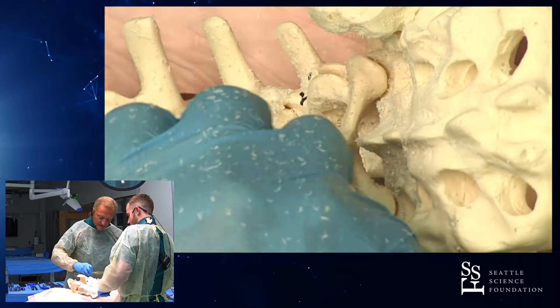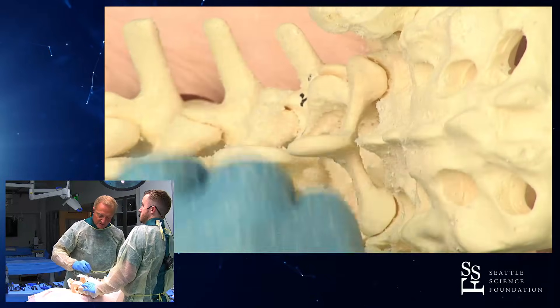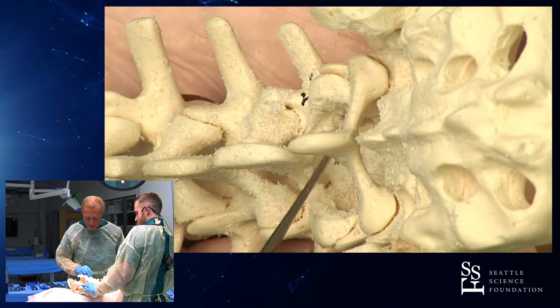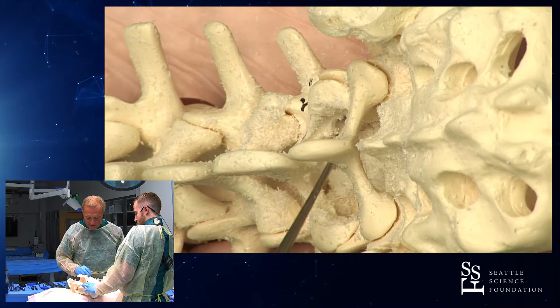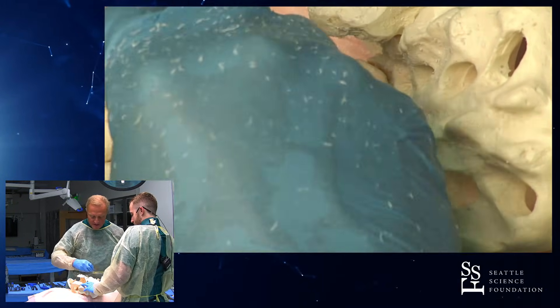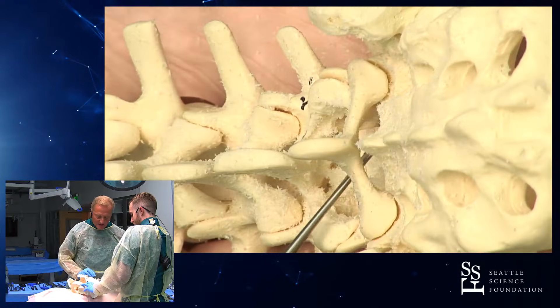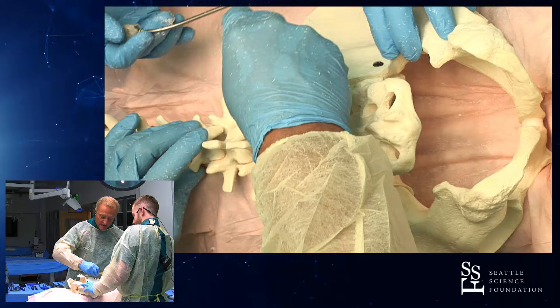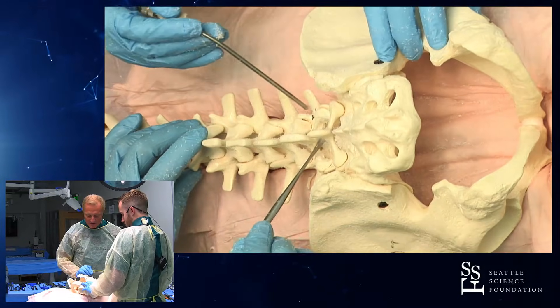The lateral wall of our decompression is the pedicle. So we have a pedicle here now. We can easily see the nerve roots above and below. The main thing to cut out is the so-called junction of ligamentum flavum and facet capsule, which is usually hypertrophied and bars entrance into your nerve root. So you have to have the DRGs clean.